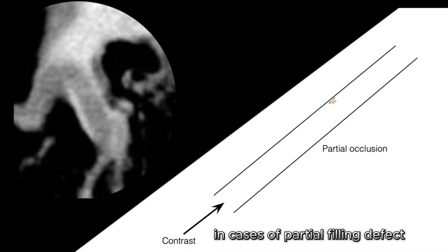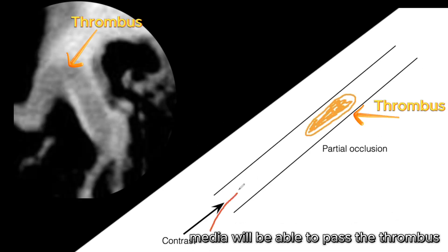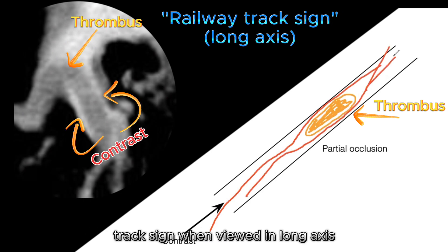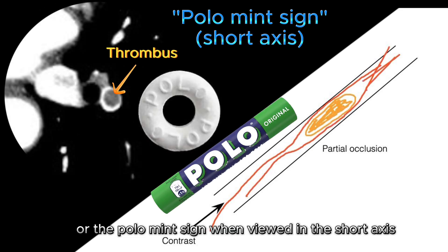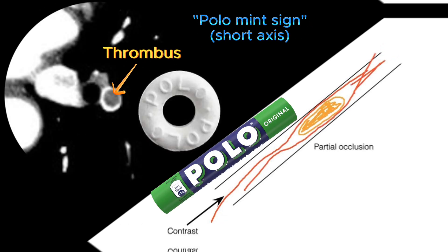In cases of partial filling defect, some contrast media will be able to pass the thrombus. This gives the appearance of the so-called railway track sign when viewed in long axis, or the polo mint sign when viewed in the short axis.